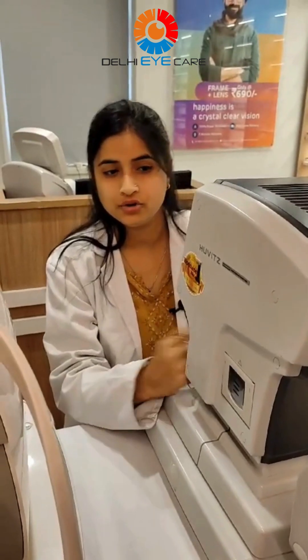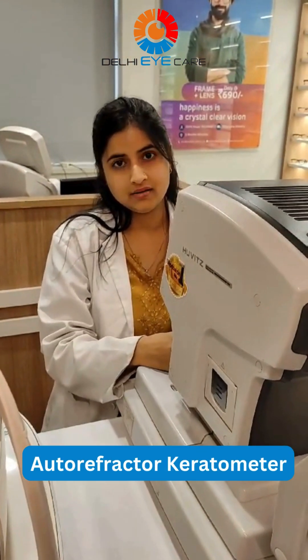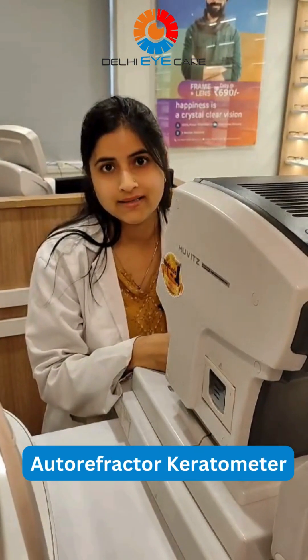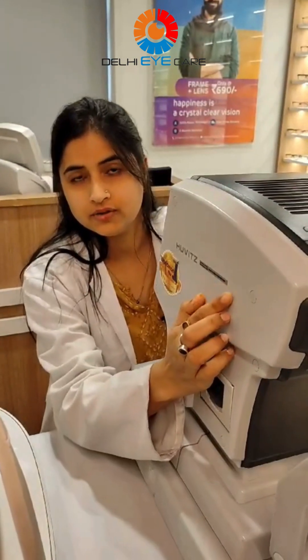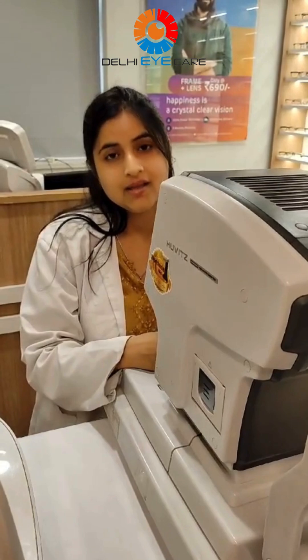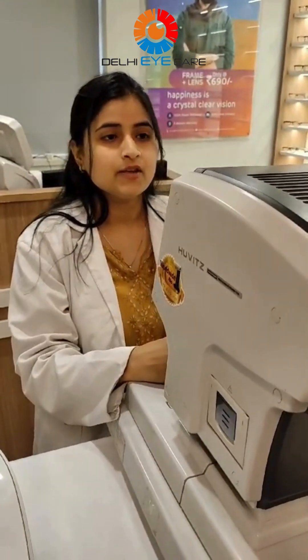Hello, myself Sonali Thakur and I am an optometrist at Delhi Eye Care. Today I am going to be explaining about this autorefractor keratometer, where we are going to measure the refractive power of our eyes approximately. Here we have a keratometer also, where we measure the corneal curvature of the eye, which is also helpful in contact lens patients.